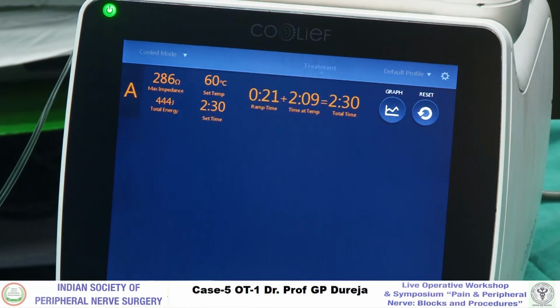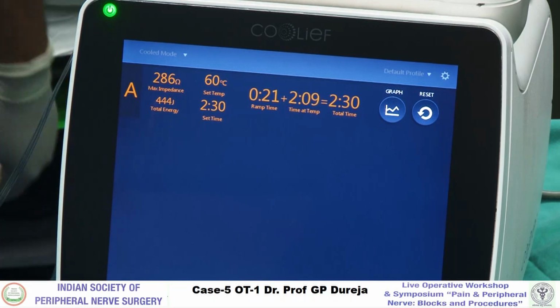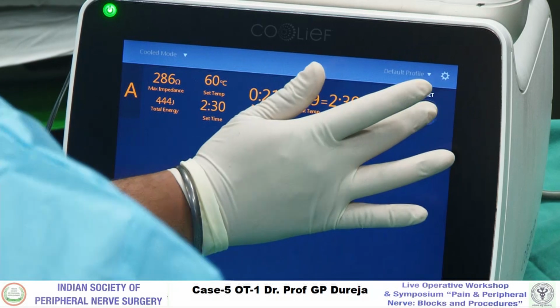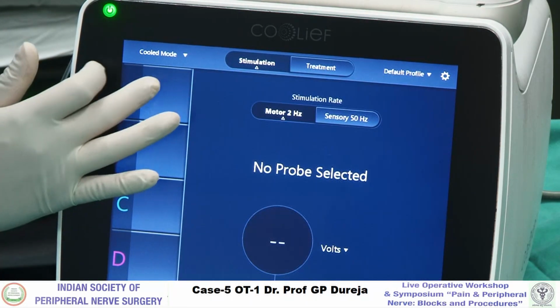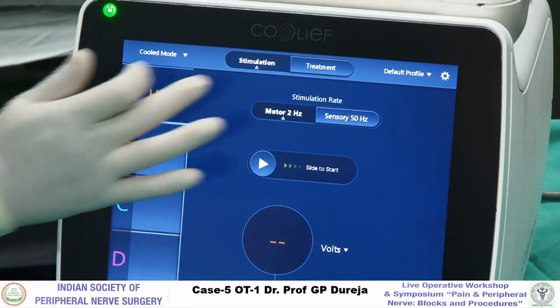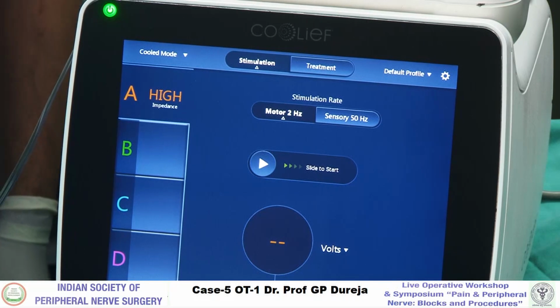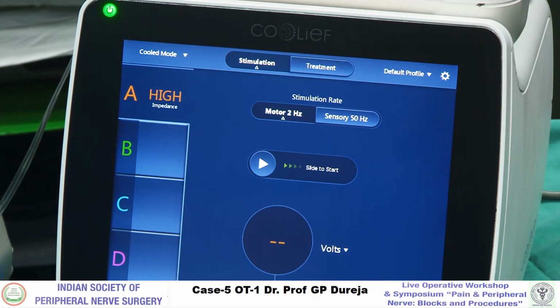And sir, this radio frequency RF catheter which you put in, what is the costing for that? How many cases can you do? No, this is a disposable catheter, so we have 2 needles in it. So this is about 35-40,000. 25,000 rupees. The RF needle in this kit is only 1,500 rupees. That can be used here, in a normal RF machine.